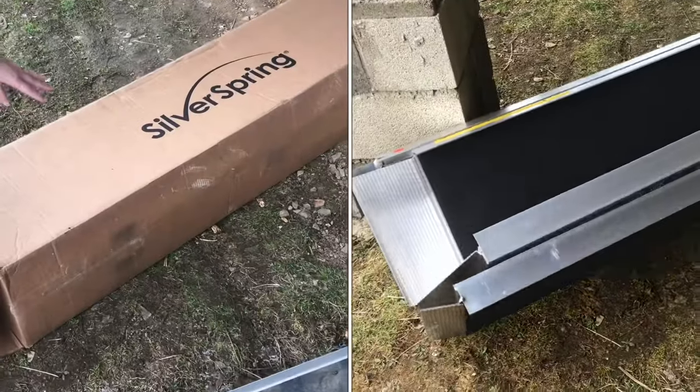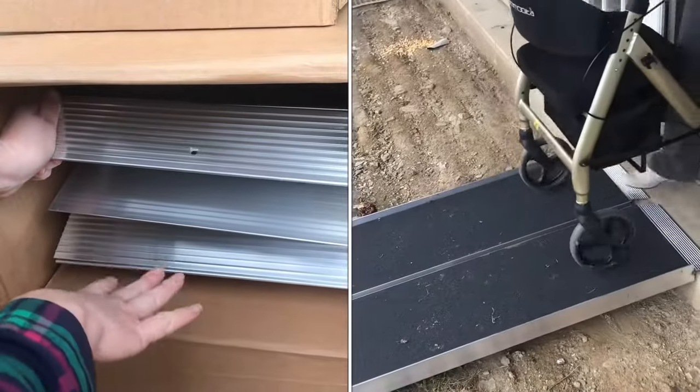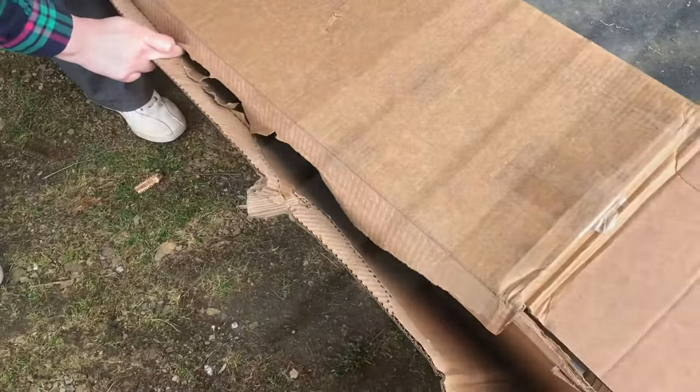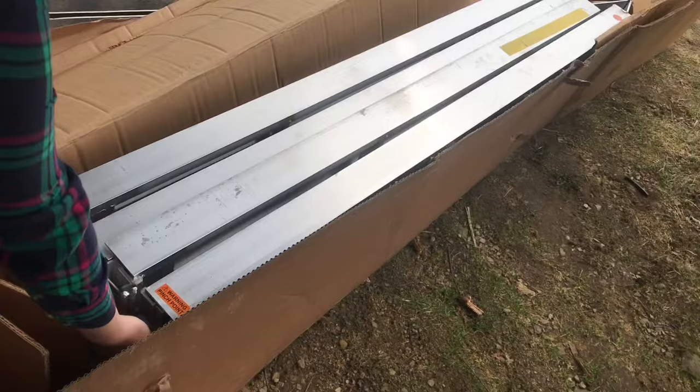We're going to do a review of this collapsible ramp from Silver Spring. This one is a 10-foot length, but it folds in half to store it as a 5-foot. It's too heavy to slide out of this skinny little box, so we're just going to break the box open. It's made out of aluminum, but with this size, it is still pretty heavy.